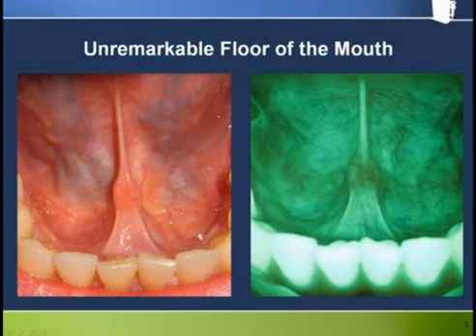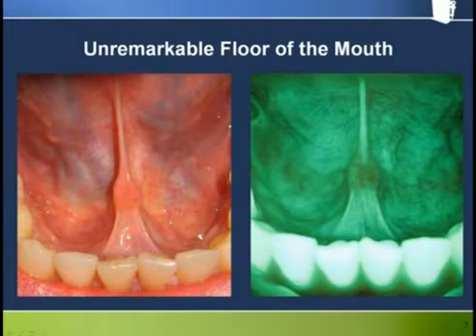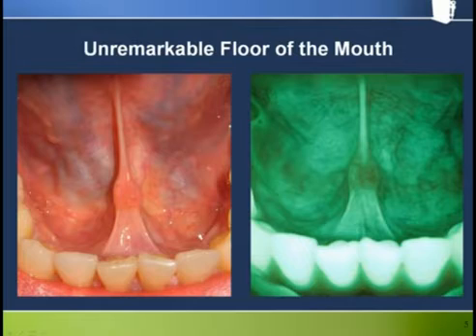This is a fairly unremarkable picture of the floor of the mouth, presenting generally speaking as a bright green with some loss of fluorescence around the sublingual gland. In a few minutes we will see that this can be much more pronounced in some cases.